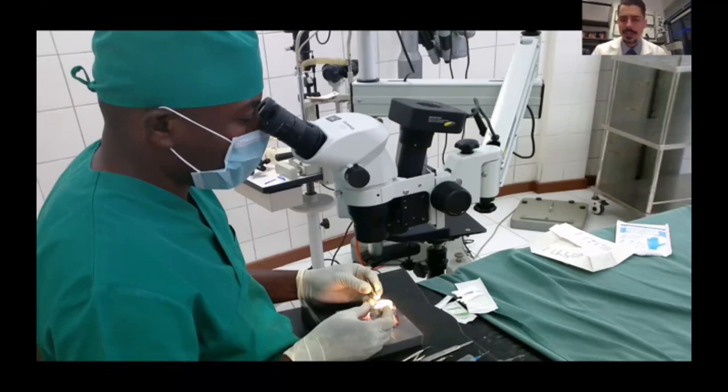And we did not use our main operating room for our wet lab. This is a secondary minor procedure area. If your center does have access to a minor procedure area or other less sterile place, that helps, because we tended not to want to bring the animal eyes and other instrumentation into our operating room. But you could certainly do that with really fastidious sterilization practices. I think any infections could be avoided.